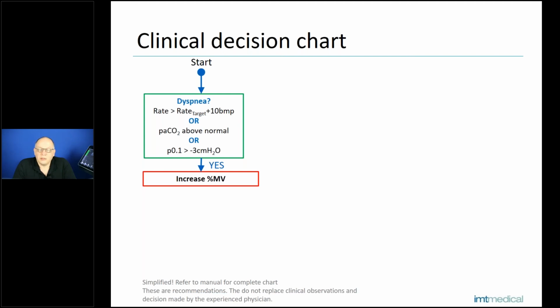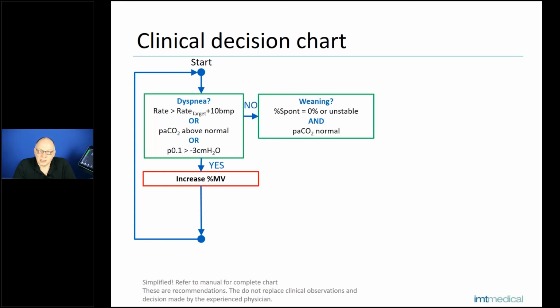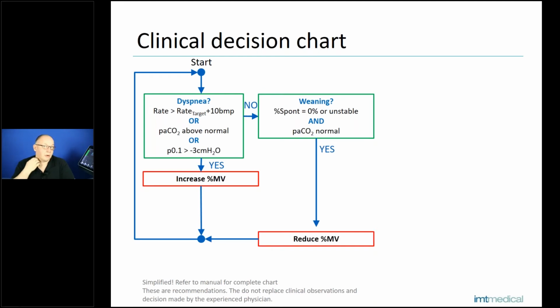it's either yes or no. When it's no, go back to start and look for the oxygenation. When the oxygenation is sufficient, then you have to look if the weaning has progressed and if the pressure support is constantly below more or less 10 centimeters of water. When it's not, go back to start and then do the whole thing again. And when you reach a point where you can say yes, you can consider a spontaneous breathing trial.